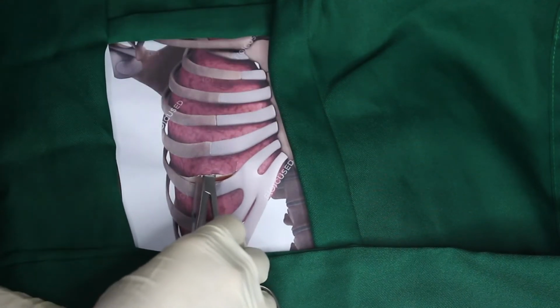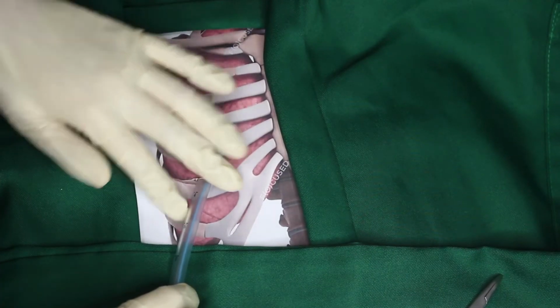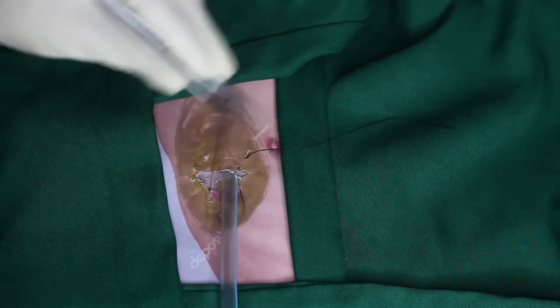Remove the large Kelly clamp as soon as the tube reaches the desired position in the chest. Palpate to ensure that the tube has entered the chest. Suture the chest tube to the skin by placing a horizontal mattress.